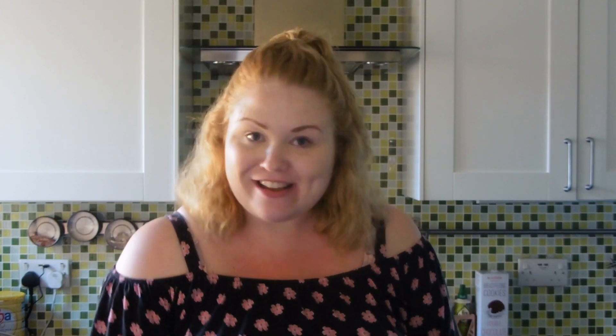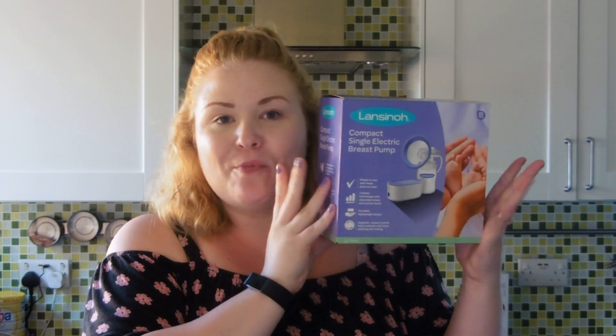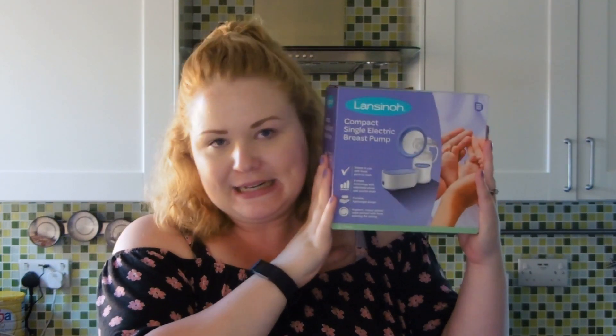This pump isn't out yet but it is coming out soon. If you want to know how you can get your hands on one of these amazing little pumps, head over to the Lansinoh Facebook page or their Instagram page and make sure you follow or like them to keep up to date on when you'll be able to get your very own. I would definitely recommend them if you are an expressing mum. The Lansinoh Compact Single Electric Breast Pump — in summary, it's amazing. It's lightweight, compact, it's got fantastic suction. What more could you want? Thanks so much for watching. Bye.